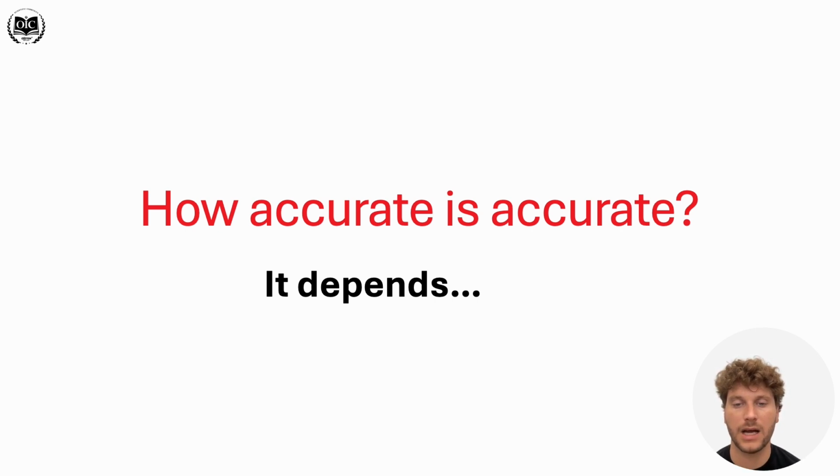Wrapping up my lecture, if you'd ask me how accurate is accurate, I would say it depends. Regarding the implant scanning accuracy, I would say 50 microns is the biggest discrepancy that we can clinically tolerate. And there are a lot of methods to improve our scanners, and with proper methodologies and the knowledge of the professional dental and dentist team, we can achieve those numbers and work in a full digital workflow.